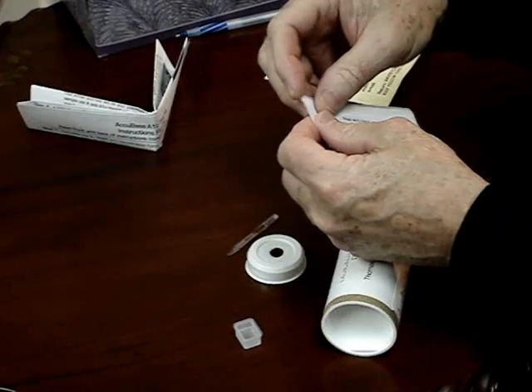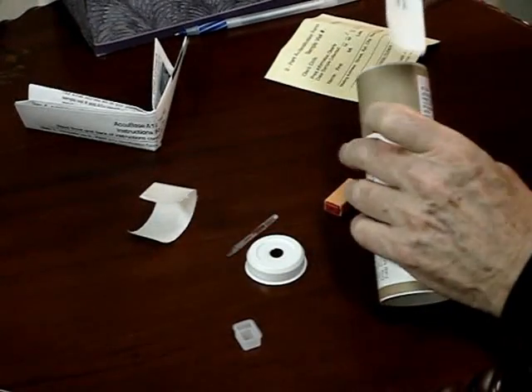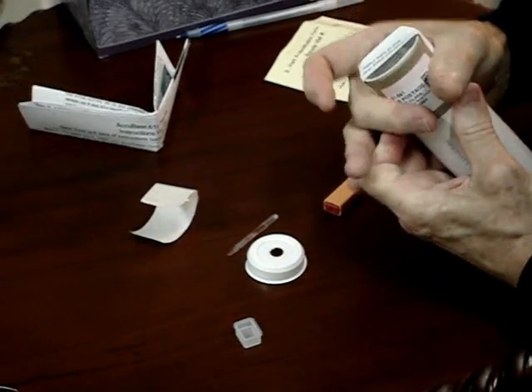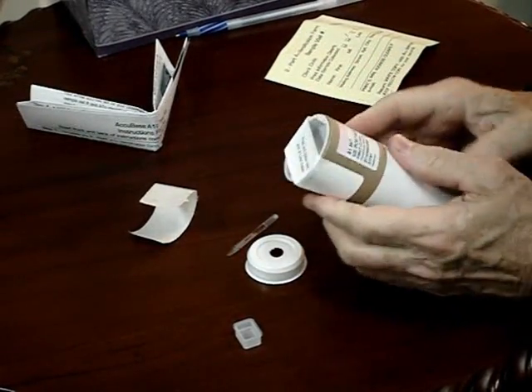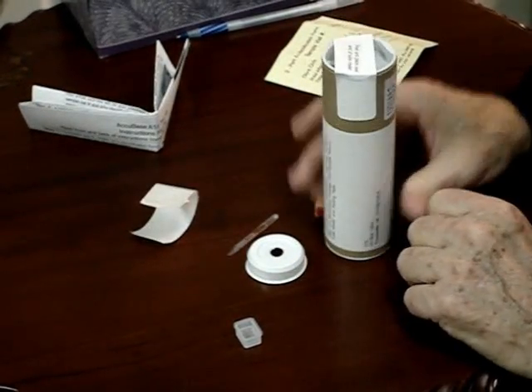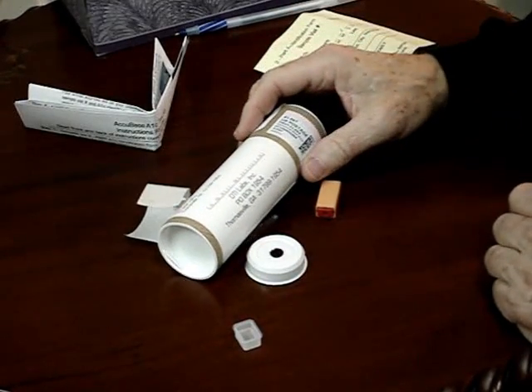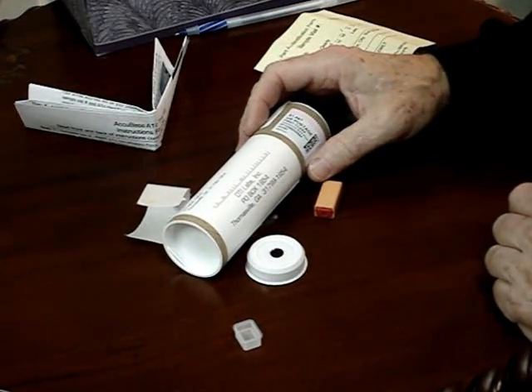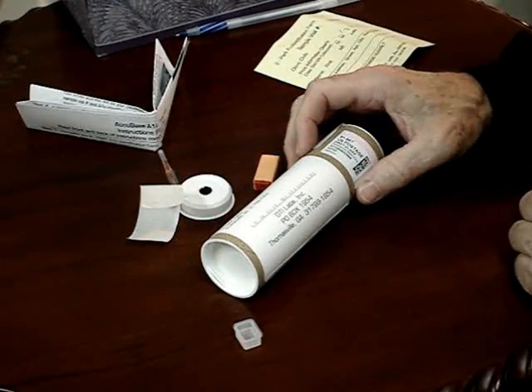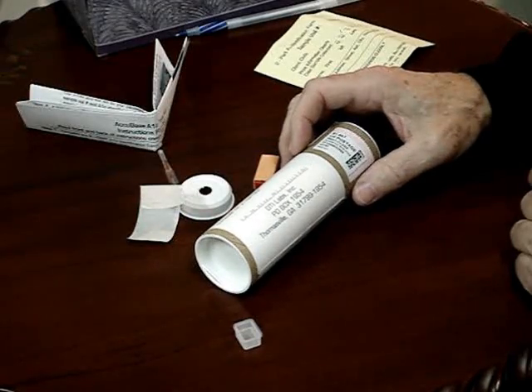The last thing we do is place this sealing tape over the end of the tube as shown. This will prevent this tube from being opened during transit. The kit is now ready to be mailed. Simply drop it in any post box or mailbox. Thank you for viewing this demonstration.